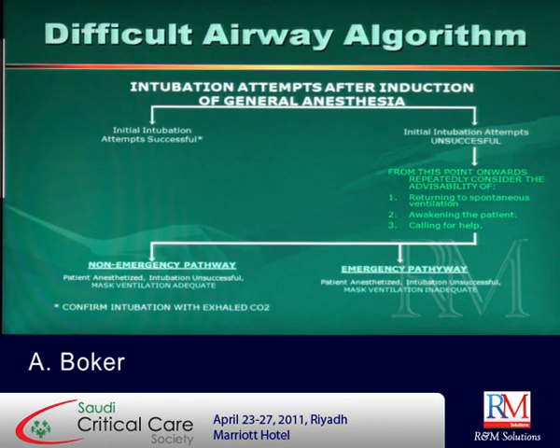Number three, available. You need to have it available. Not at the office of the director. He's the big boss and it's expensive and he locks it at night. So it's useless. Even if you know it and you're proficient and you know it's there, it's useless. Unless it is on a difficult airway cart that's movable, it is not useful. And number four?